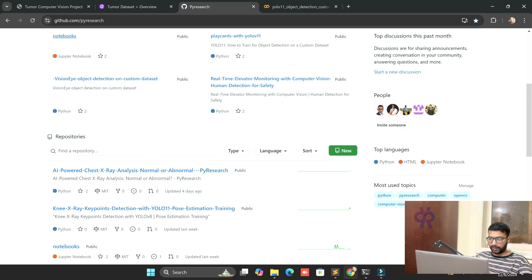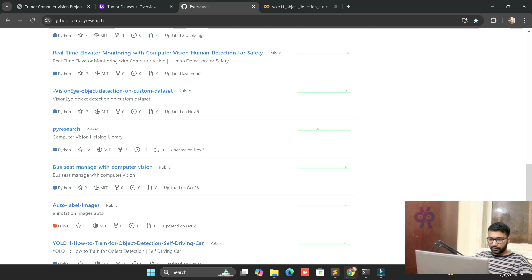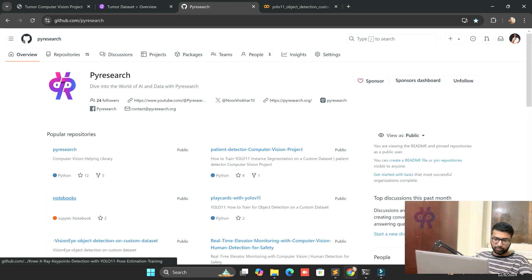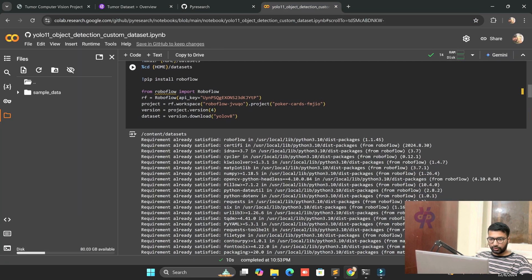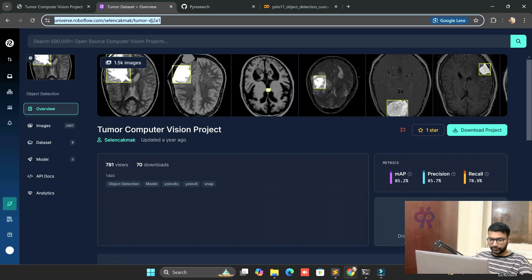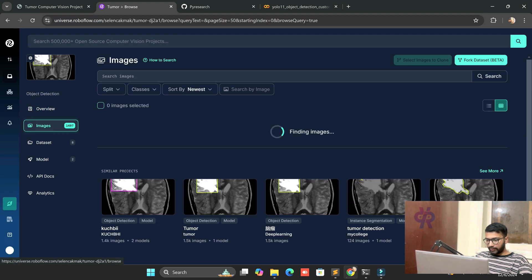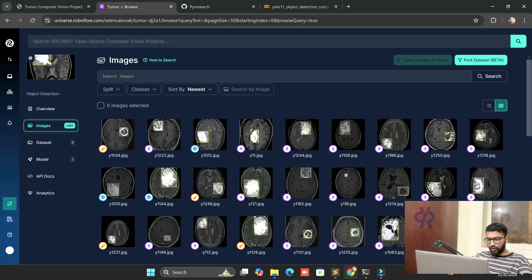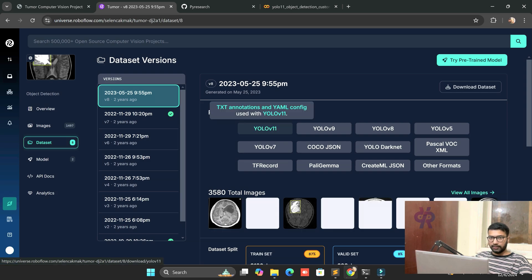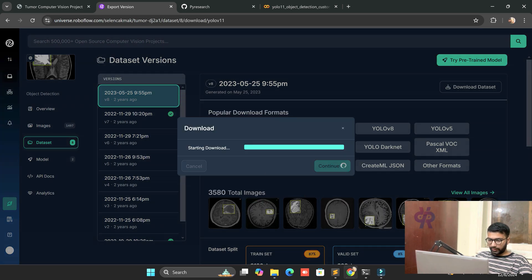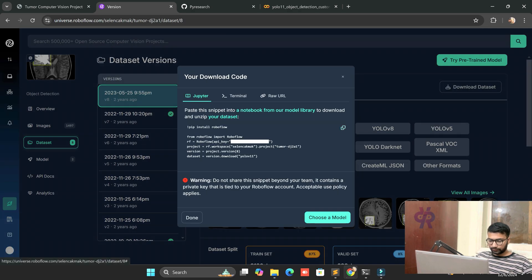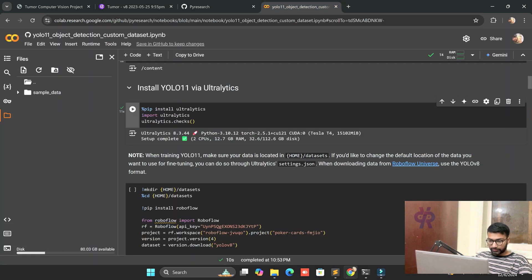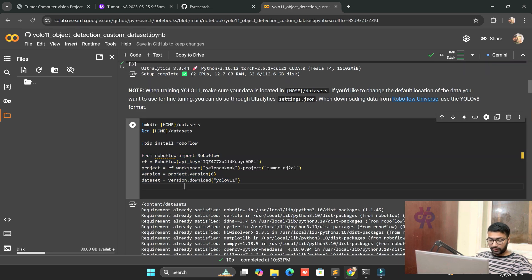You can see the Roboflow site. We just go to Roboflow Universe dataset, and it's also open source. Just click the YOLO 11 format and show the code. After copying and pasting here, we involve our dataset with our API key.